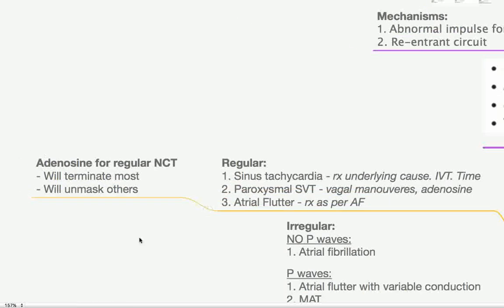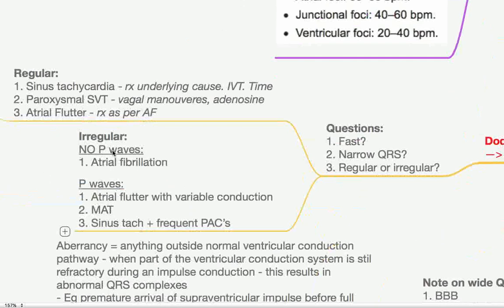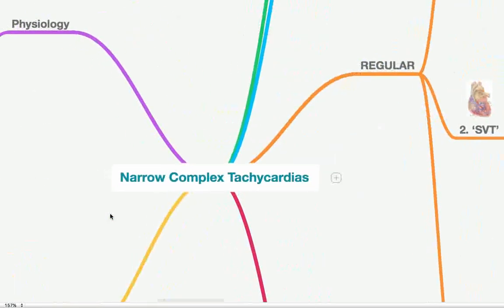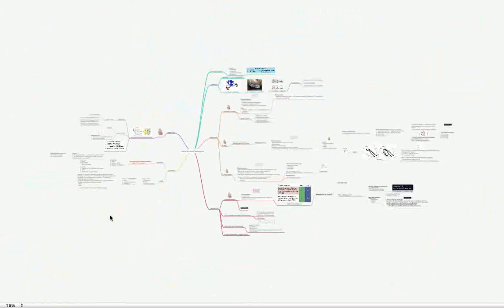If it's irregular and there are no P waves, then you've got atrial fibrillation most likely. If there are P waves, it could be atrial flutter with variable conduction. Could be having a bit of 2 to 1 block here, a bit of 4 to 1 block there. Multifocal atrial tachycardia is another potential. If there are those multiform P waves. And then finally, sinus tachycardia with just random frequent premature atrial complexes thrown in could also be another potential. So thank you very much for watching. I hope that was somewhat helpful and I wish you all the best.